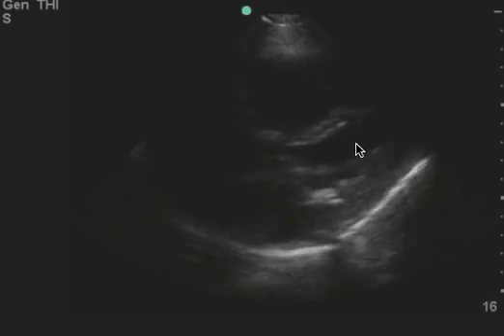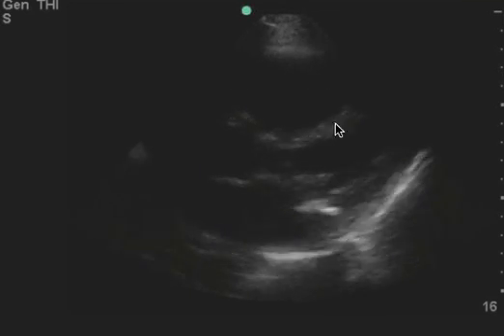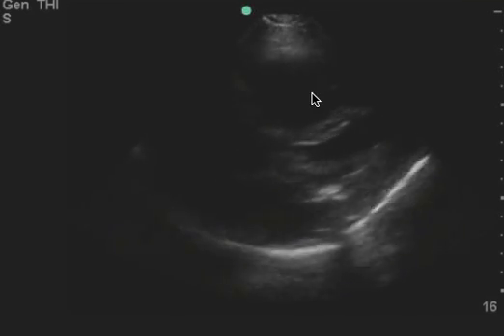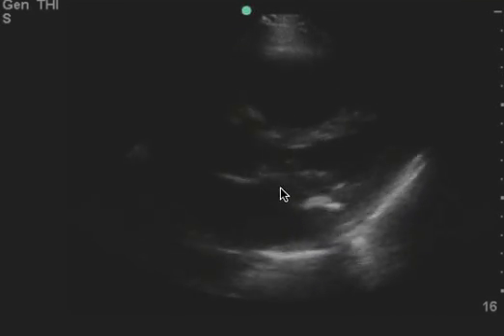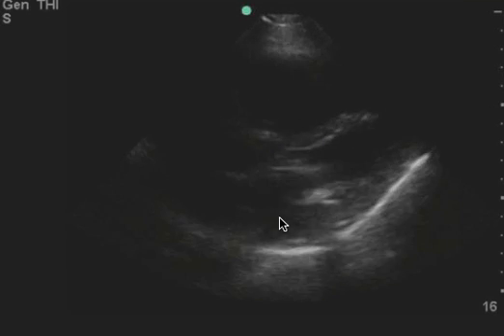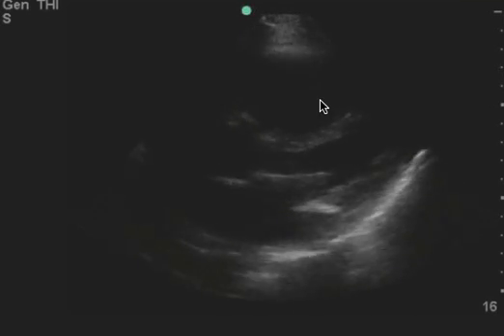You can then compare the left ventricle to the right, and the right is definitely much bigger. So to me, this is someone who has more diastolic heart failure.